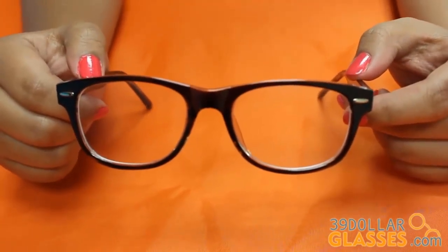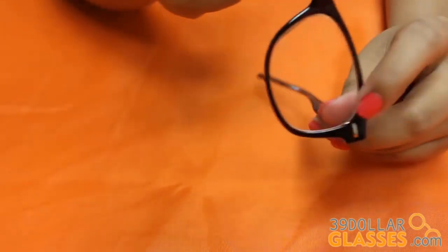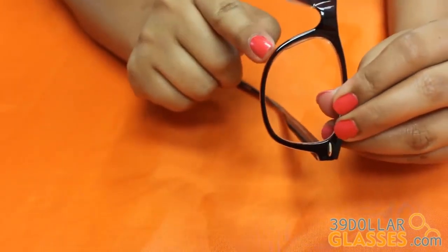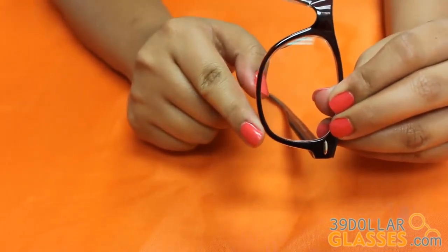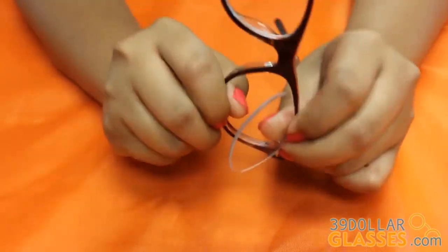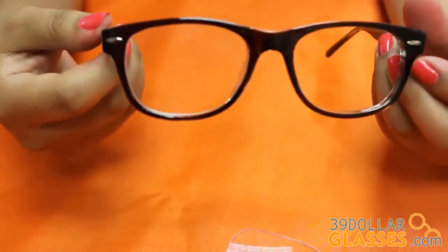To re-lens a plastic frame, pull on the top and bottom parts of the frame that are touching the lens to loosen it. The lenses sit on a groove inside the frame and are never glued in. Next, pop the lenses away from you through the front of your frame using your thumb. Do the same on the other side.